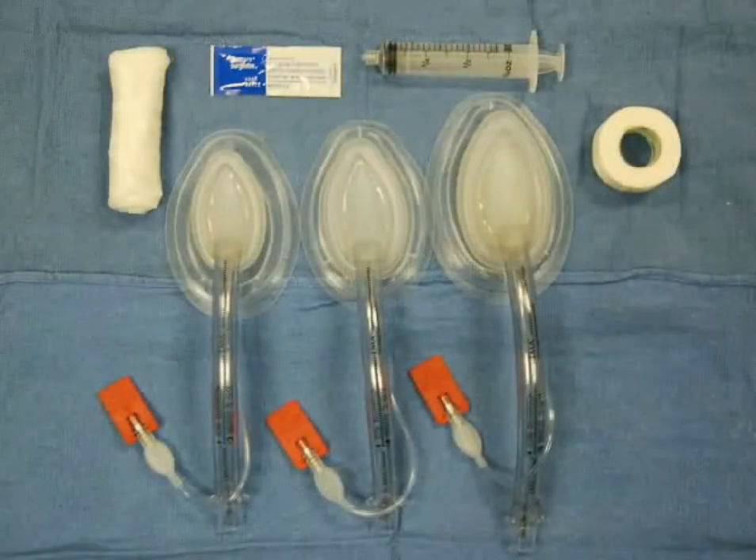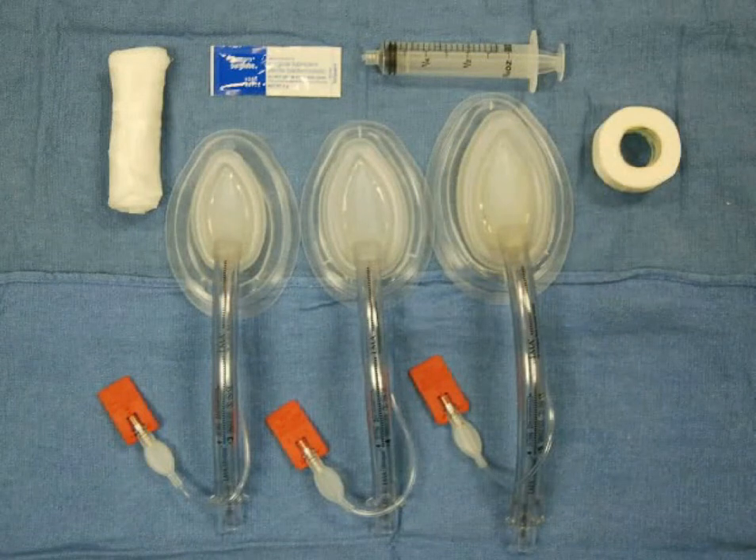Prepare your equipment prior to starting the procedure. Choose an appropriately sized LMA and obtain lubricant, a clean syringe, a bite block, and tape. Also, as for any procedure in which you are manipulating an airway, obtain all emergency airway supplies required for intubation.